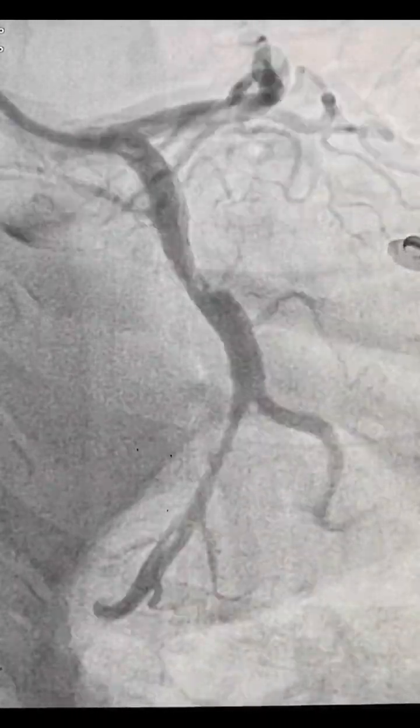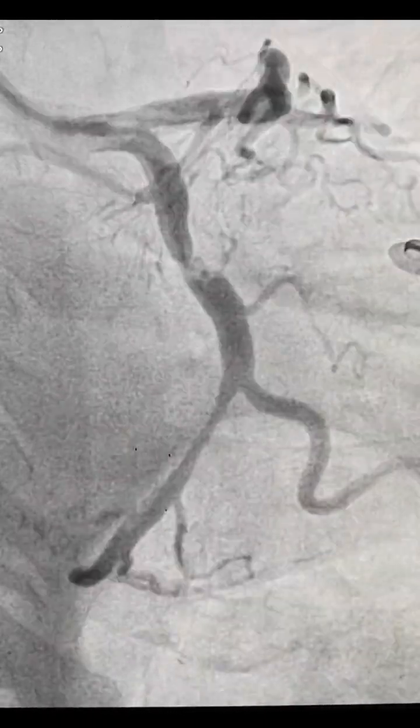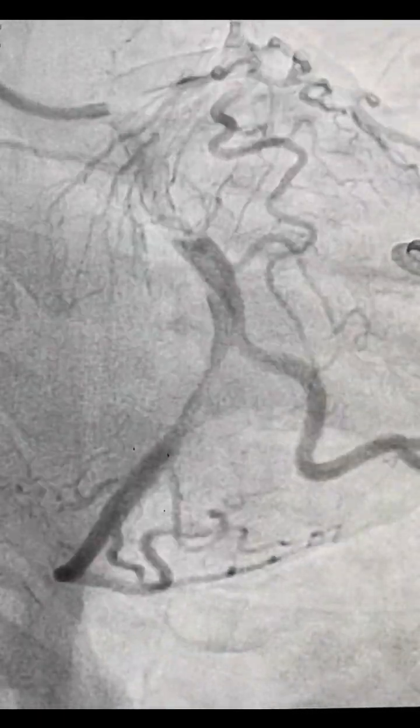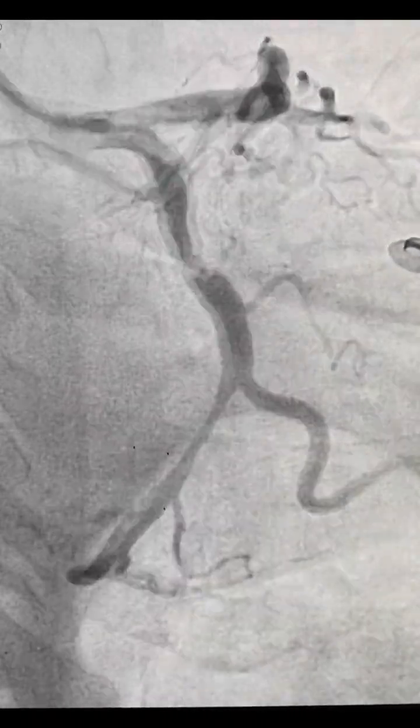The largest size of stent available was 4.5 on the shelf. So we decided to put a 4.0 stent in the distal LCX and a 4.5 in the proximal LCX, and planned aggressive post dilatation with the 5.5 balloon in the proximal LCX. So after all clearance, we decided to proceed with the angioplasty.